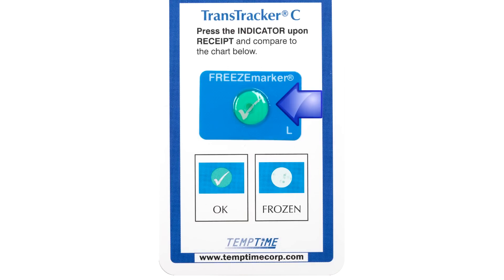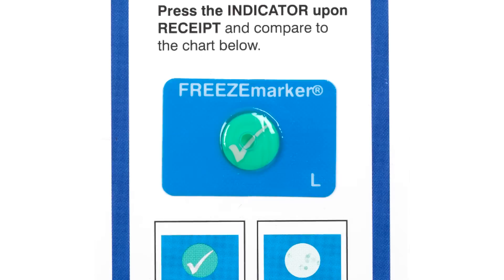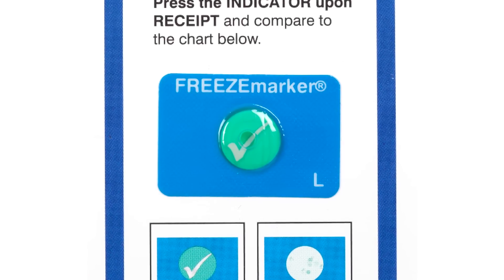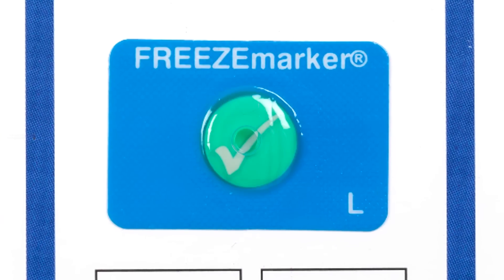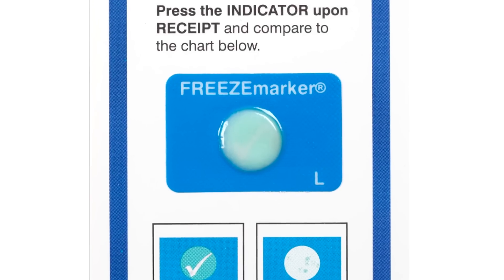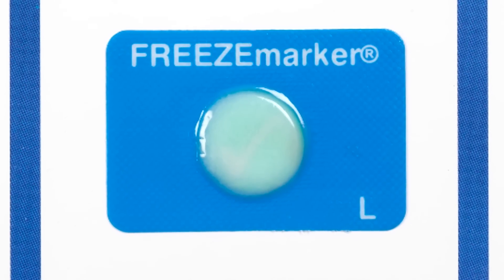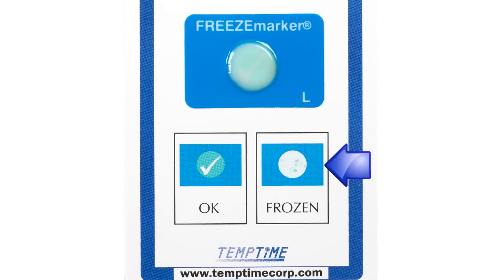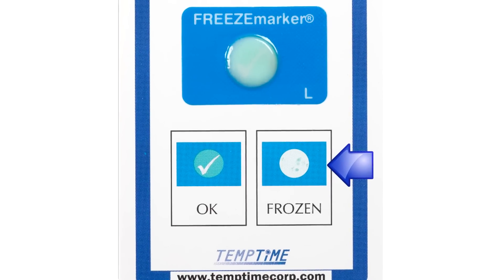If the fluid appears transparent and you can clearly see the green dot with the check mark, it has not been exposed to freezing temperatures. However, if the fluid appears white or milky, it has been exposed to freezing temperatures, as noted in the images just underneath the blue label on the TranTracker C.